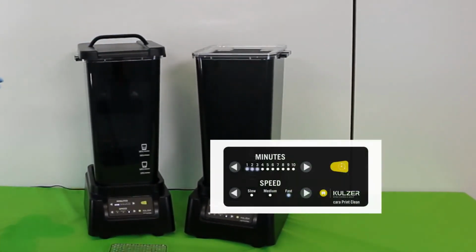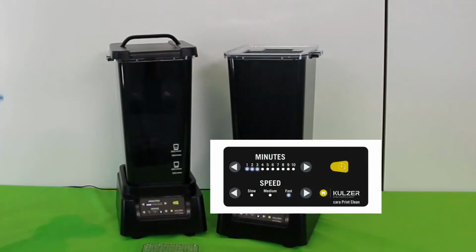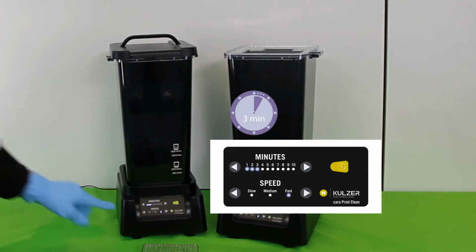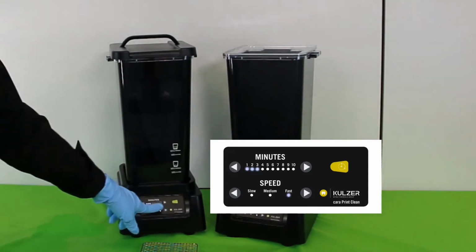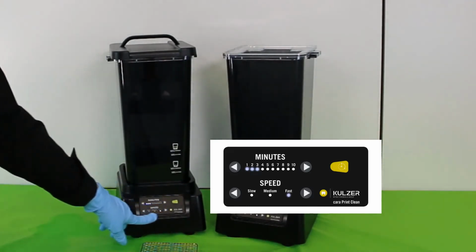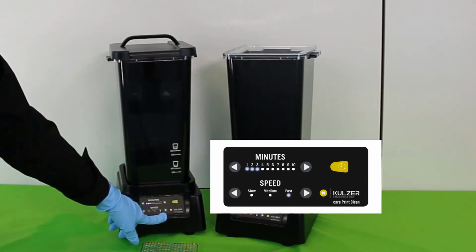Enter the cleaning time according to the print material used with the arrow keys. The cleaning time and procedure depend on the material of the printed objects. For all Dima print materials, the first cleaning time is 3 minutes. Proceed in the same way with the stirring speed. This should be set to fast for all Kulzer photopolymers.